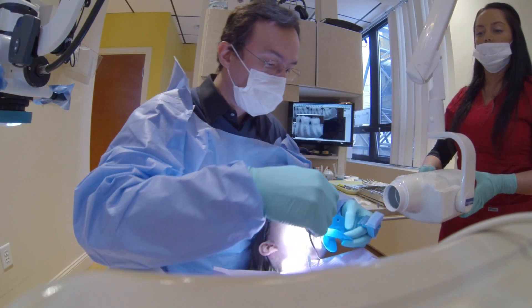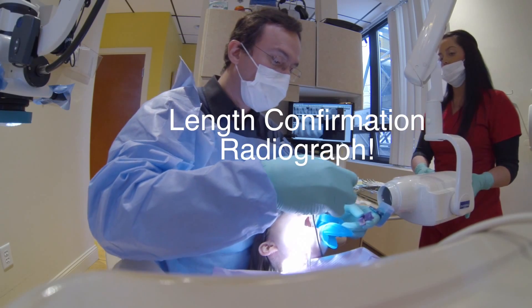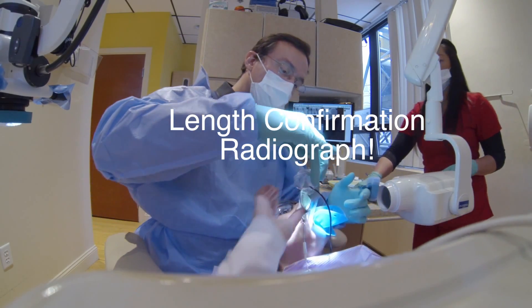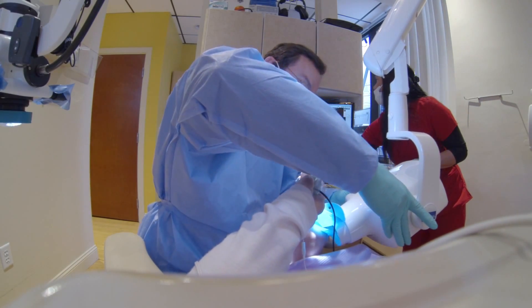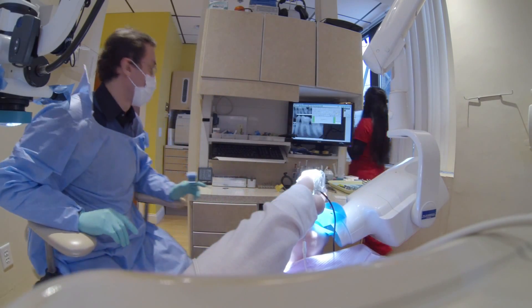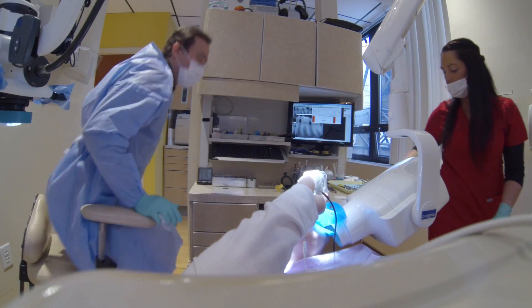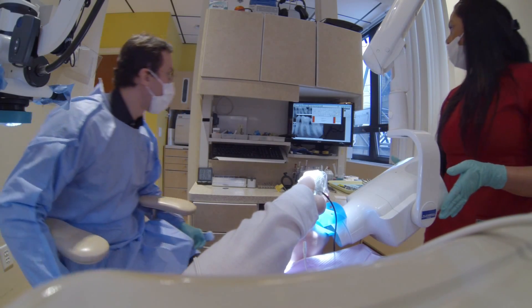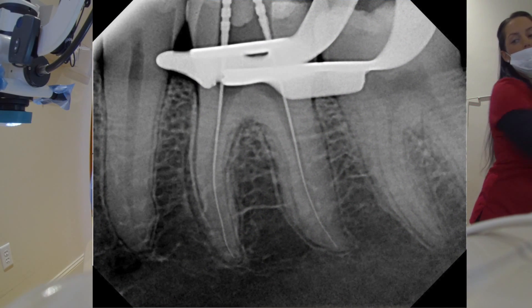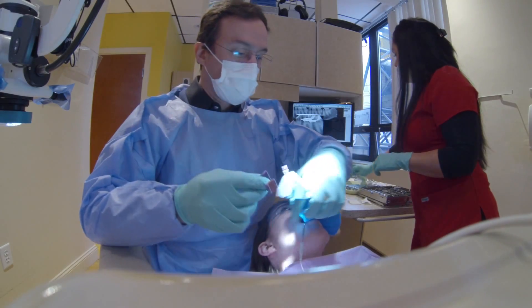At this step I like to take a radiograph. Since the access preparation is fairly small, I place two files — in the mesiolingual and the distal — and take a radiograph. Digital radiographs are wonderful because they allow us to have almost immediate information about our length measurements. Within a few seconds I already have the image and I can see that the measurement taken with my apex locator is fairly accurate — I'm comfortable with these lengths and will proceed with the rest of the instrumentation.